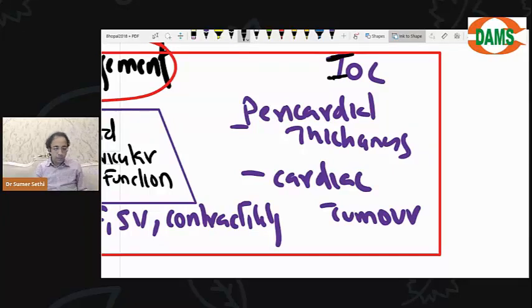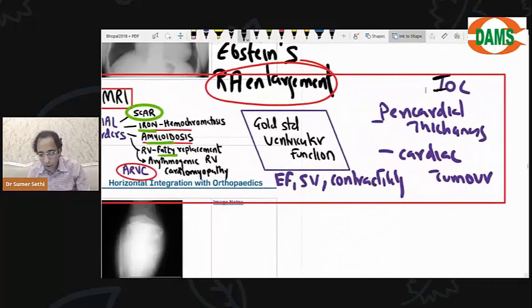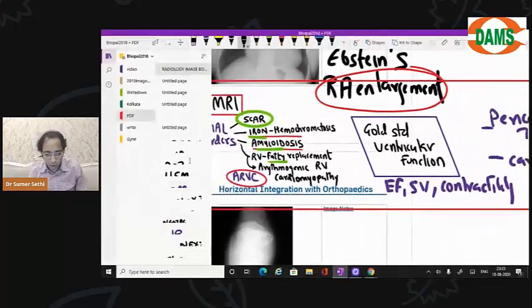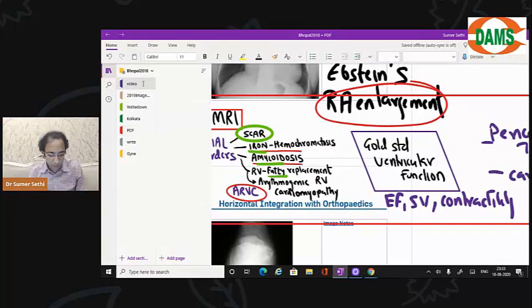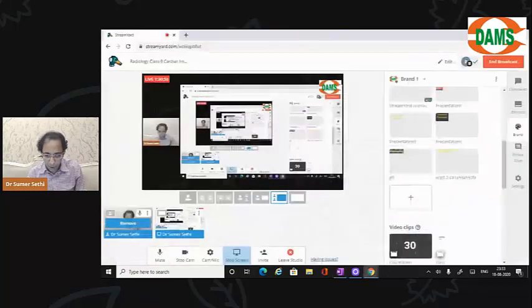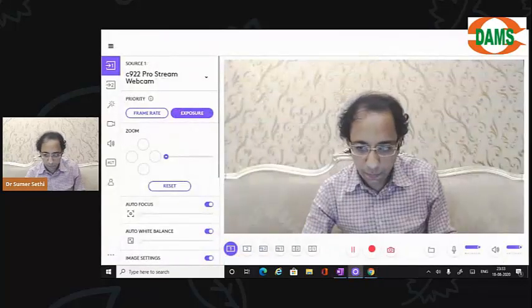Okay. Now, how does it look like? Let's try to understand before we go forward. Have you ever seen a cardiac MR? Okay, let's see if we can show you.